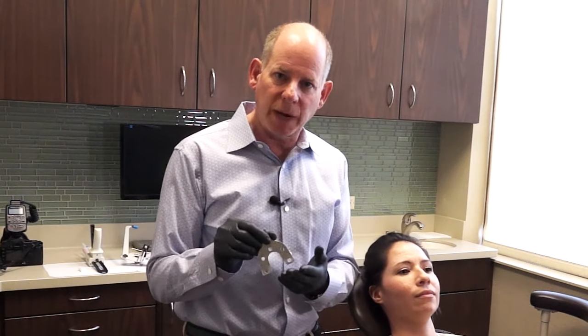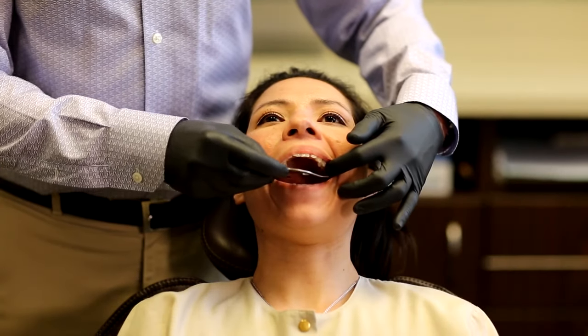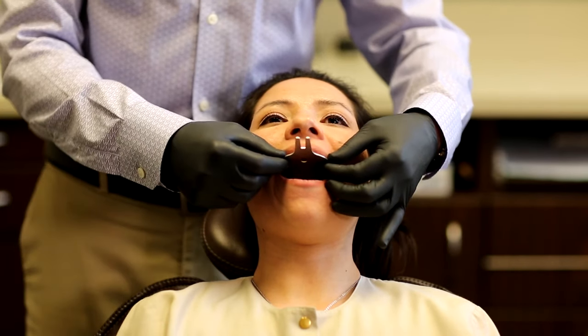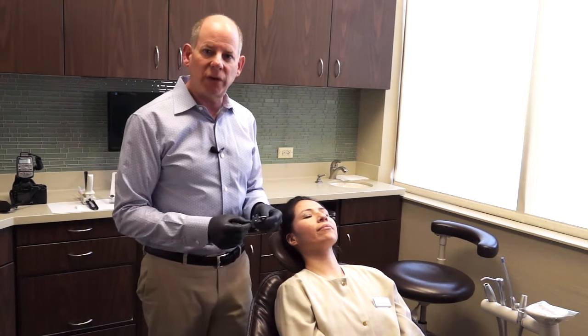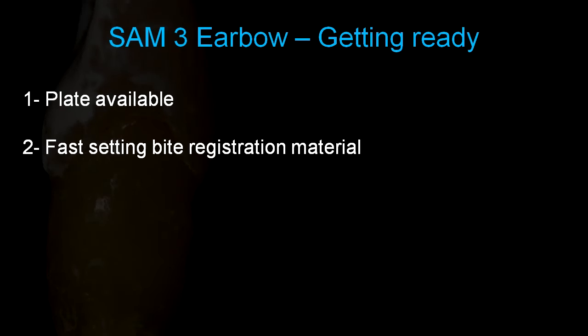We start with the upper plate and try it in. I lean Erica back and when I try in the upper plate, it's almost like putting in an impression tray — I slide and turn it in, making sure the middle of the plate is centered in the patient's face, standing behind the patient to verify centering. You need a few things ready: the plate, a fast-setting bite registration material, a couple of cotton rolls, and a timer to know when your material has set up.